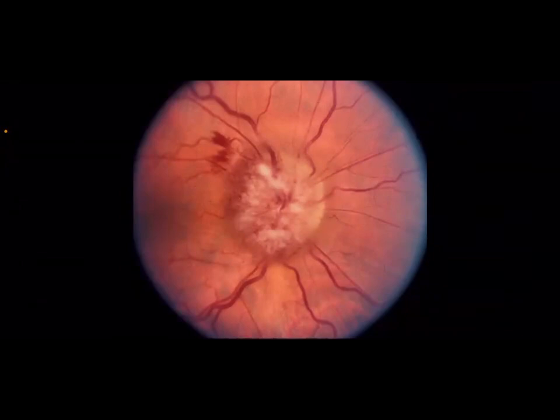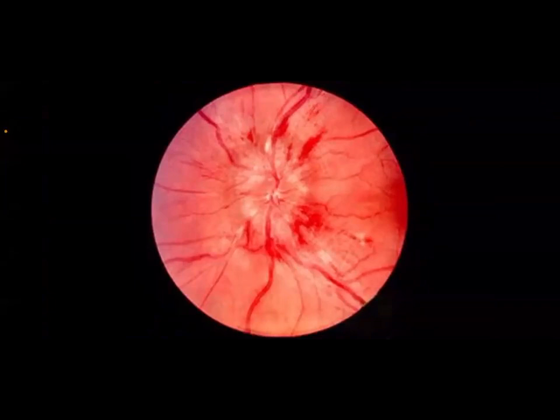We go out of the optic disc again by following the same blood vessels, now looking for any abnormalities in the blood vessels. Sometimes we will find small dots, red dots, small red circles on the vessel wall. This is a microaneurysm, a ballooning of the retinal vasculature.